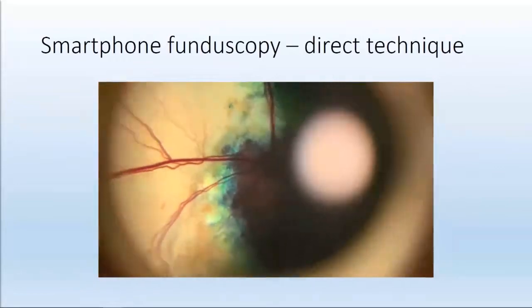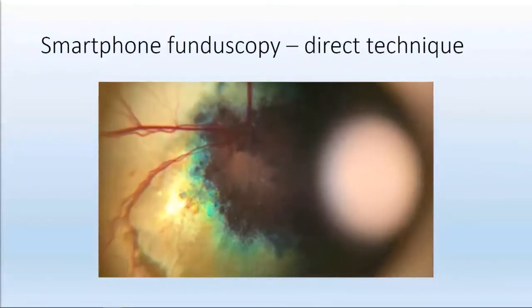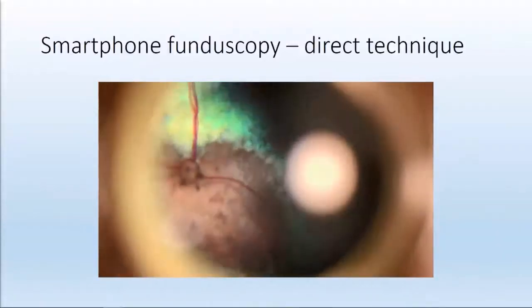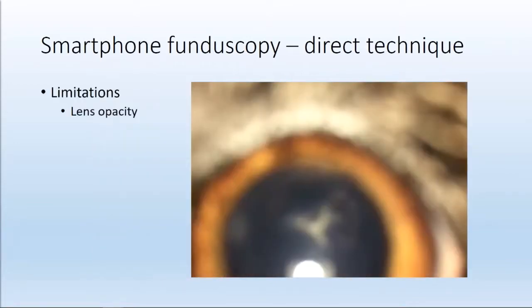But just incredible quality, better than the majority. We just bought a $15,000 fundus camera that we're really disappointed takes images that are much worse than this.